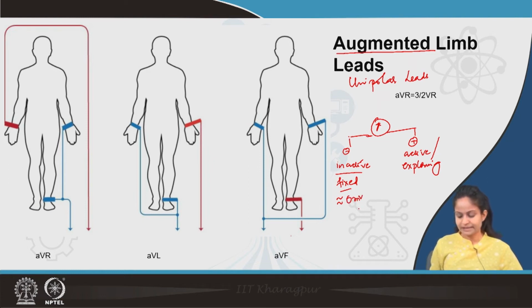When we combine the electrode terminals with very high resistance of, say, 5000 ohms, we get the voltage across this equivalent to 0. Practically or mathematically we do not get 0, but we get values close to 0. So, it is better to use the term fixed in this case.